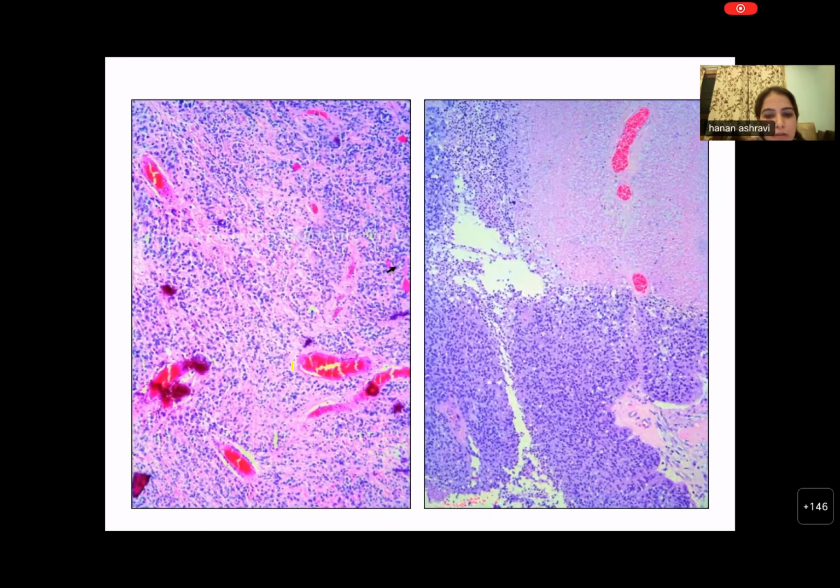This is a cellular smear showing congested and dilated blood vessels. So it's not a smear, it's a slide. Actually, you can say that these are representative photomicrographs showing a cellular tumor. Okay. Yes, sir. In this picture, this area you can see here. What is this one? In the right upper corner is necrosis. Yeah. So a cellular tumor with necrosis and quite a vascular tumor. You can see a lot of blood-filled vascular spaces.